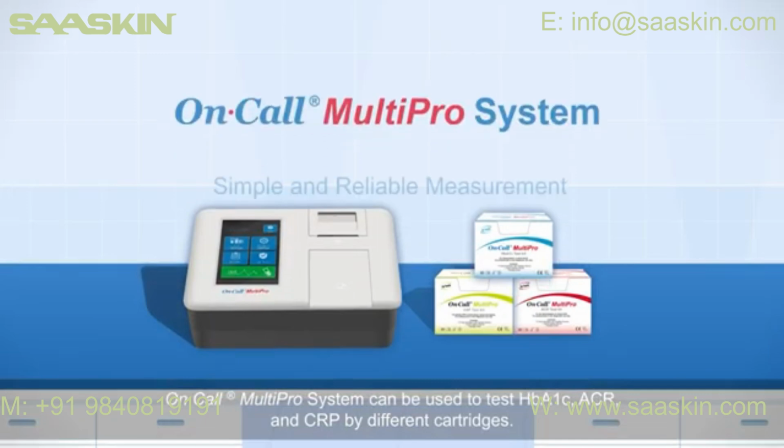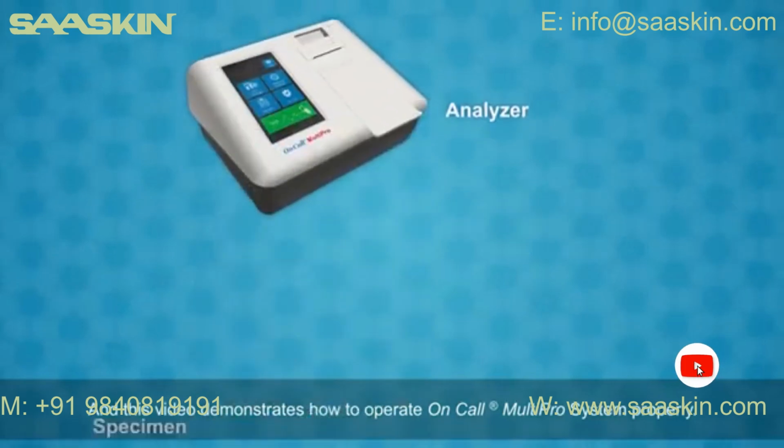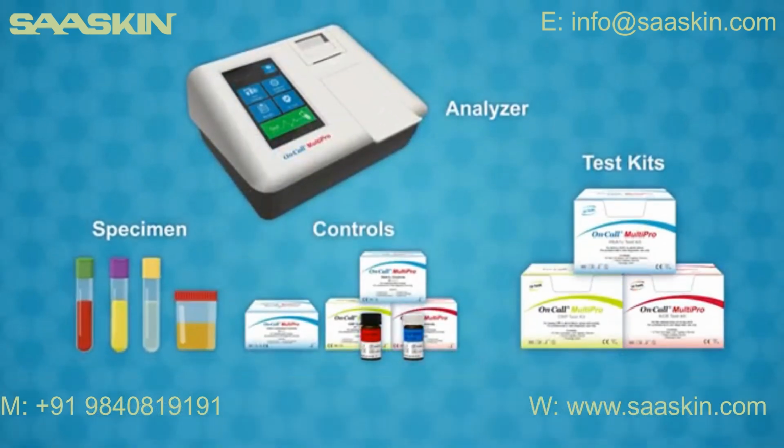On Call MultiPro system can be used to test HbA1c, ACR, and CRP by different cartridges. And this video demonstrates how to operate On Call MultiPro system properly.